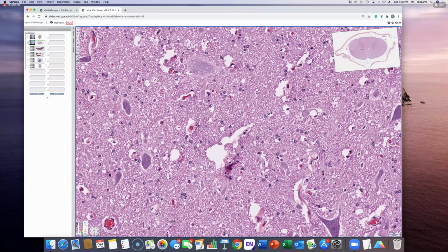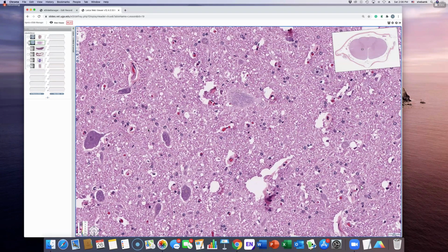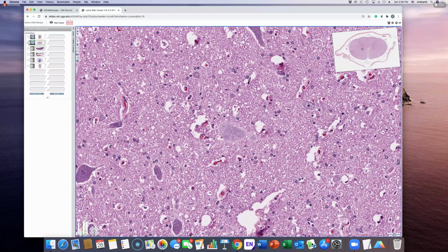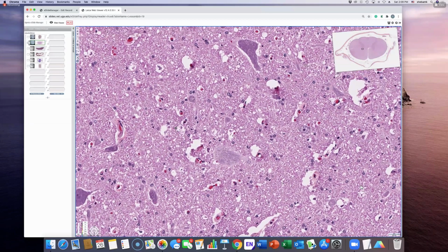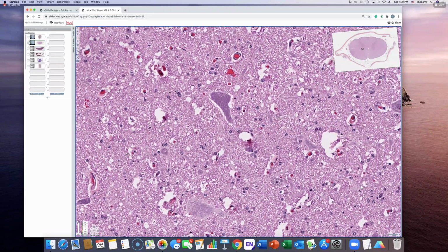But the astrocytes, you will find them around blood vessels, but those are the largest glial cells that you find among the 3 different glial cells. These are all microglia, those are all microglia. Okay, so that is that.